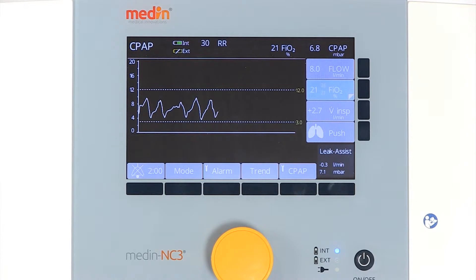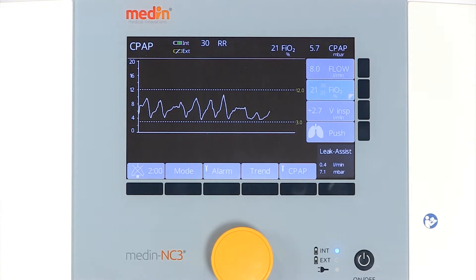If there is a difference of more than 0.5 millibars from the target pressure, leak assist will increase or decrease the flow to maintain the target pressure.